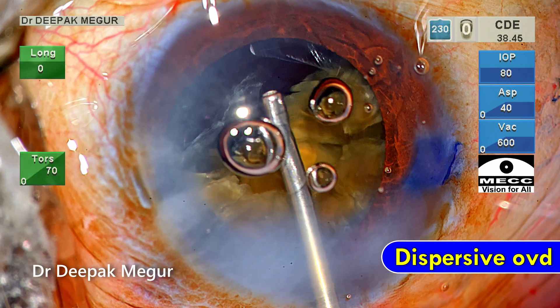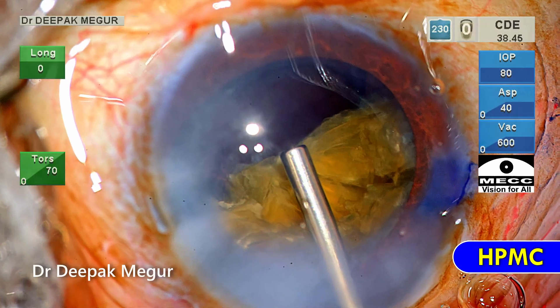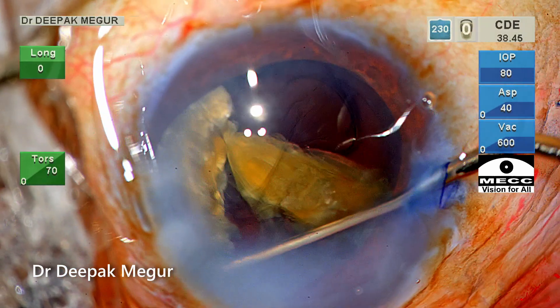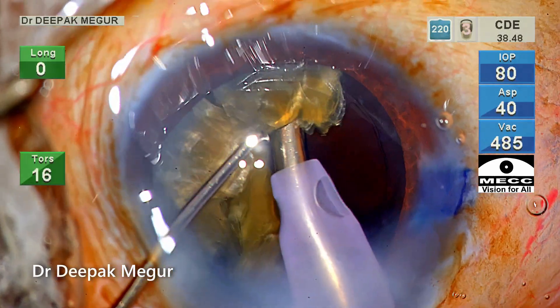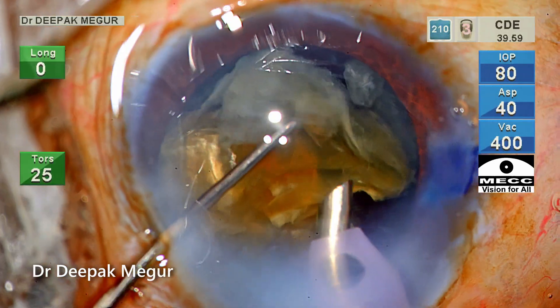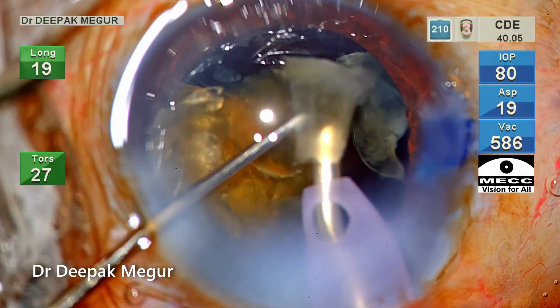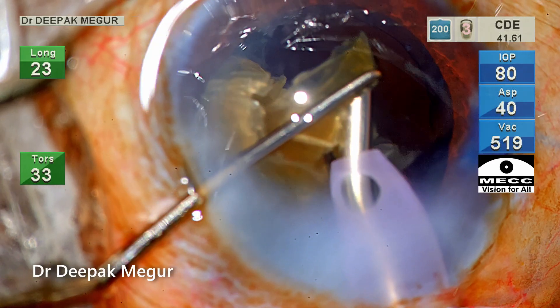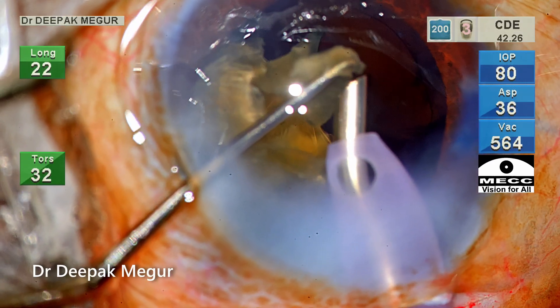Time to replenish the OVD. A dispersive OVD goes in first, followed by HPMC underneath it. The single most important reason for trauma to the endothelium is lens fragments jumping up and hitting the cornea — mechanical trauma plays a significant role. We need to control this by using adequate power, minimizing lens chatter, and using the second instrument to prevent fragments from flying away.